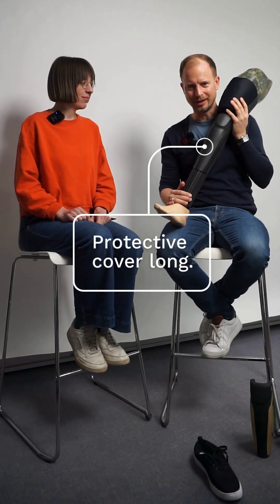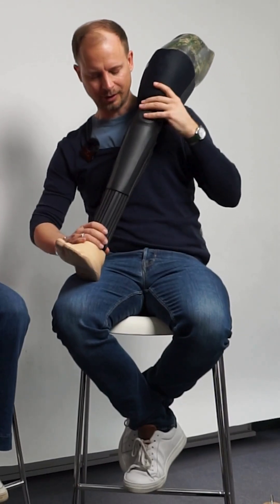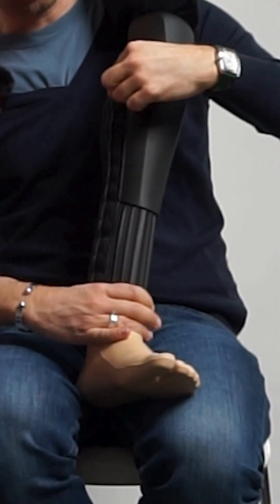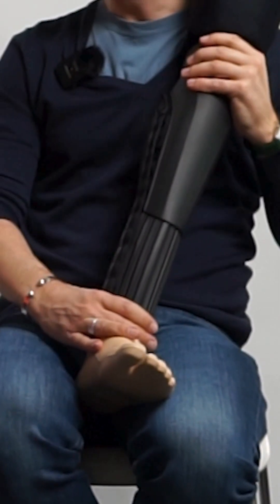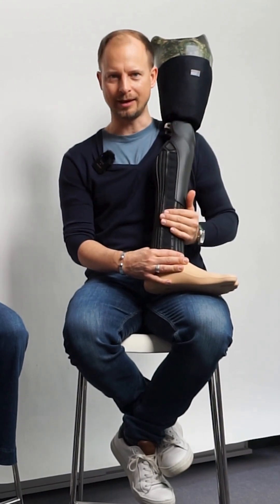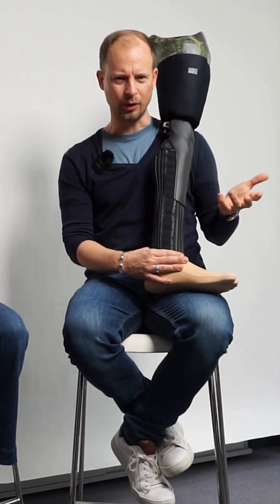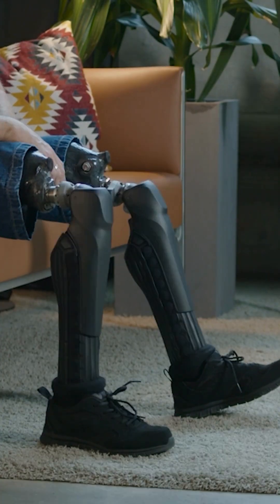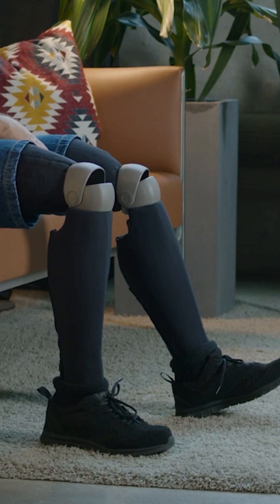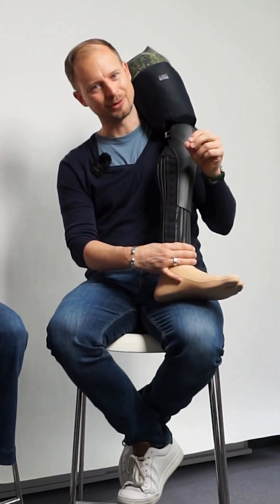The next cover solution is the so-called protective cover long. A good advantage is that you can really easily open and close it by a special closing system, so it gives you the volume around the ankle. The long protective cover was usually fully made out of injection-molded pieces. As they were basically hollow, they were not soft. Since the back side here is only textile covered with polyurethane, it's as slim as possible and still protects your knee joint.